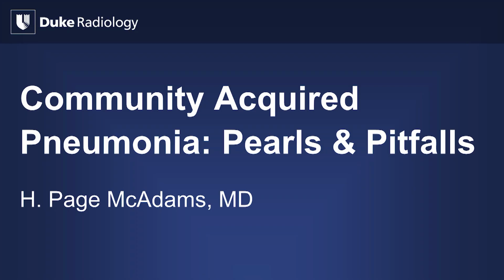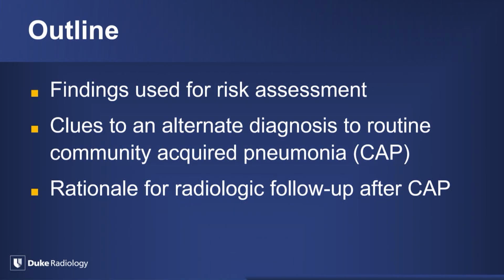When Jared asked me to give some talks, he said that there were some requests for some plain film focused talks, so these will be that. My outline this morning is I'm going to talk very briefly about radiographic findings that are used for risk assessment by our clinical colleagues.